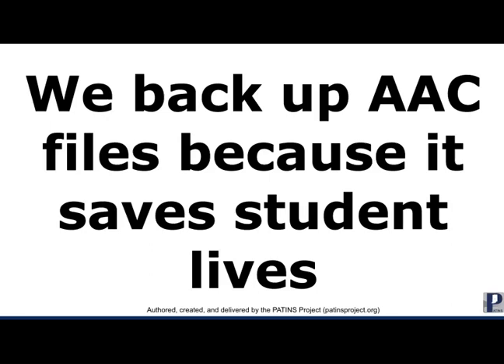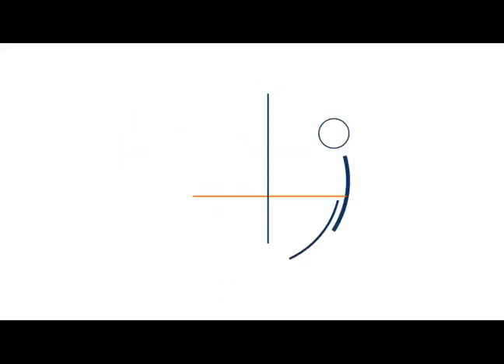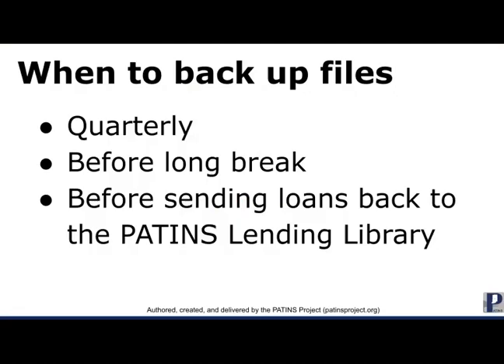Knowing how to back up your students' augmentative and alternative communication software will save you time and energy, and it might save your student's life. Backing up AAC software files is part of standard care for an AAC device.